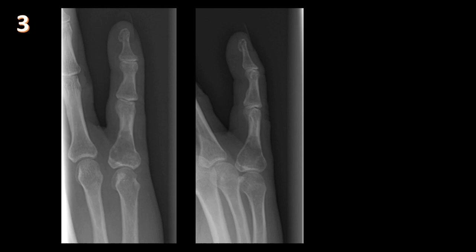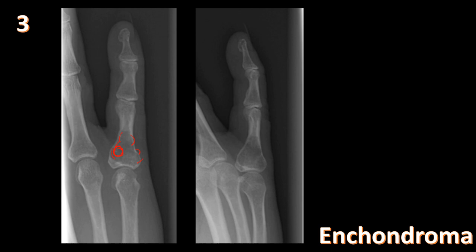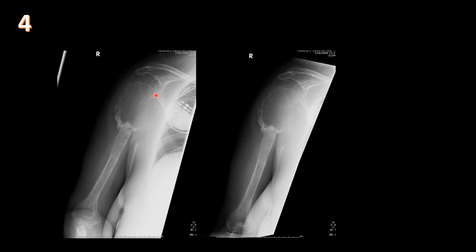Third case: views of the little finger show a lucent lesion within the base of the proximal phalanx — slightly expansile, with endosteal scalloping and a small chondroid matrix. This is an enchondroma. For the boards, any lucent lesion that is slightly expansile in the hand should make you think of enchondroma first. You don't need to see chondroid matrix, but when present it helps confirm the diagnosis. The lesion weakens bone and may be associated with a pathological fracture.